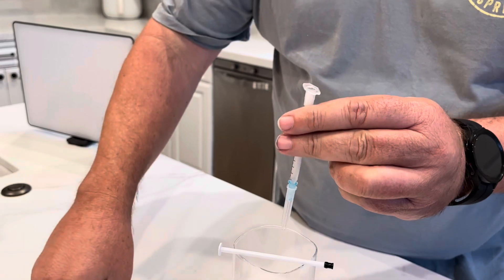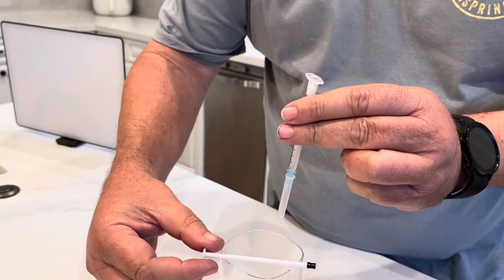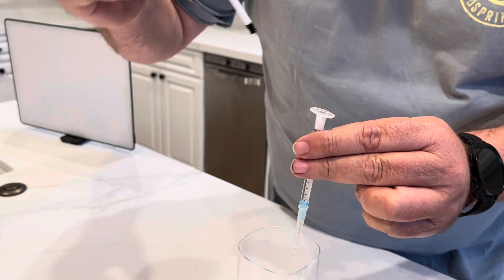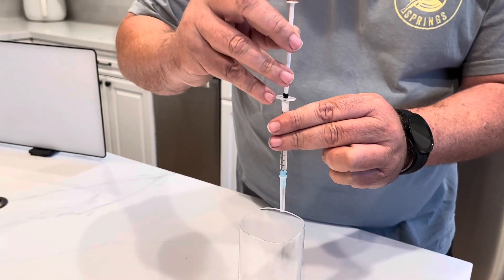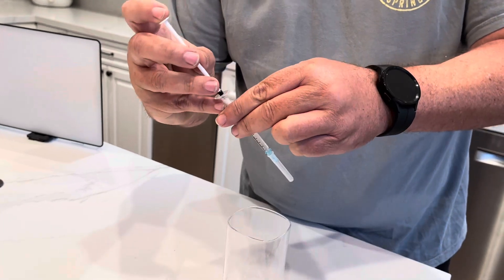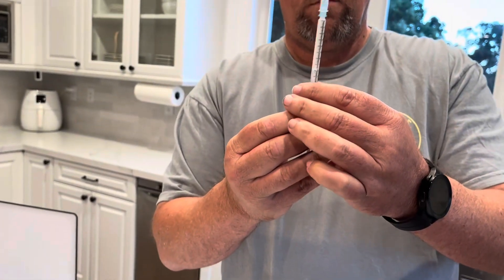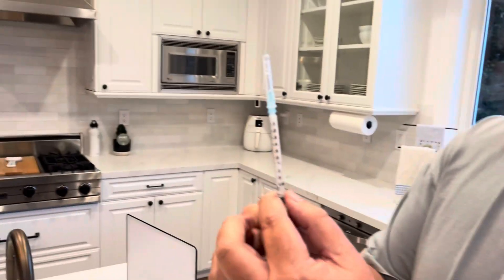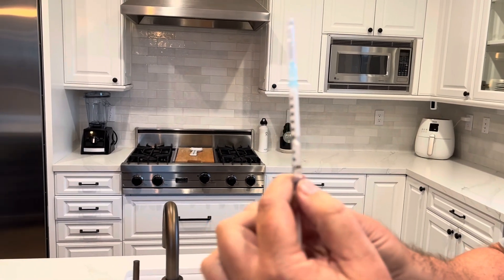At this point you have your 0.75 milliliters of Ozempic safely in the TB syringe, acting as the intermediate vessel. Now we're going to reinstall the plunger, but you can't press down here because it'll come out of the needle. You have to turn it over carefully, let the bubble settle a bit, and then you can remove the excess air.